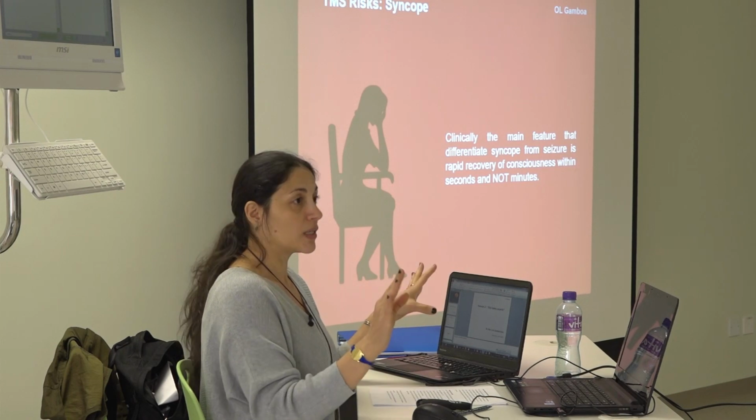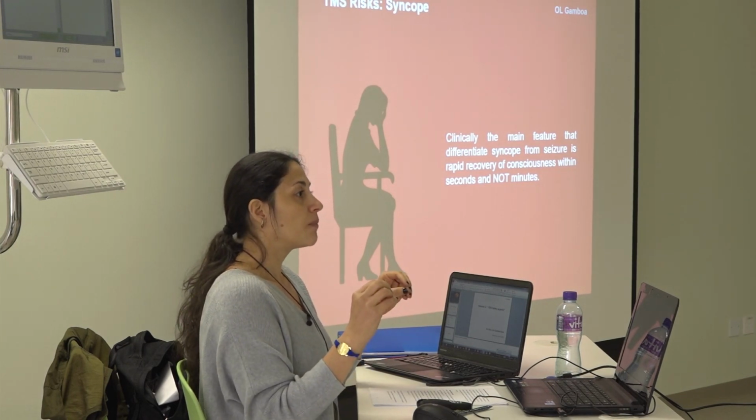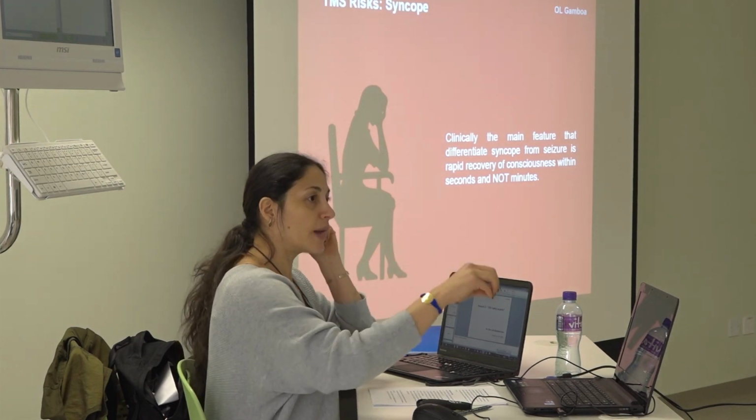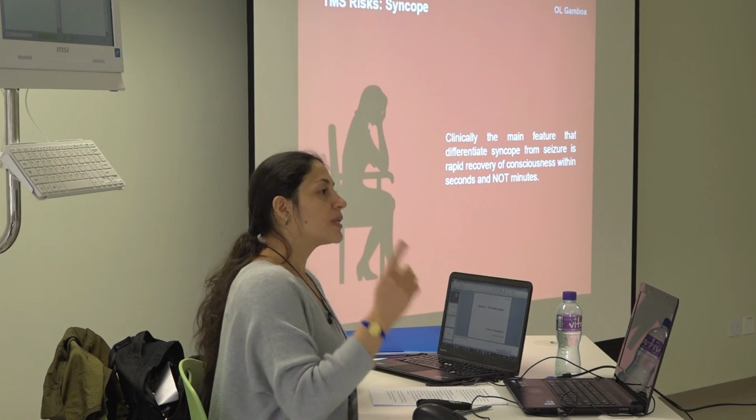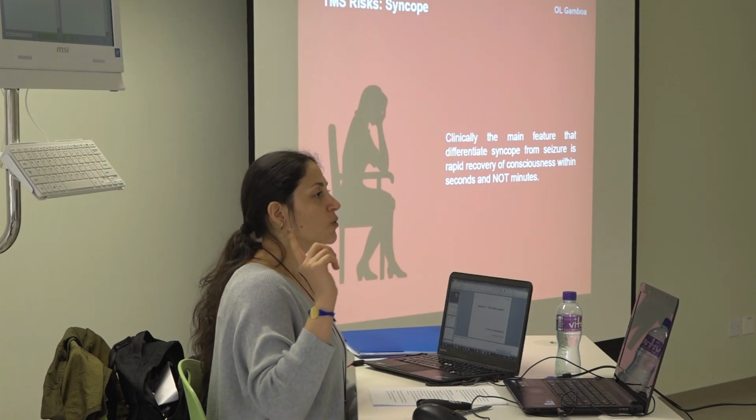The seizure lasts longer, and I have never had a seizure, thankfully. But I have seen someone who had it, but it was not with the stimulation. They were going to stimulate, and before that it happened, so it was not TMS related. I don't know why it happened. So it's very important that you learn to react in the case of syncopes and seizures.